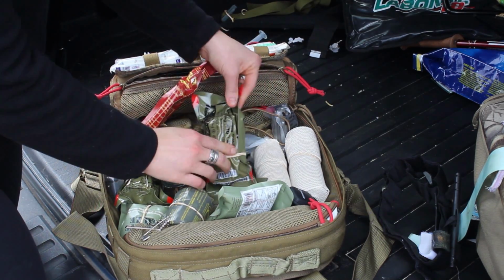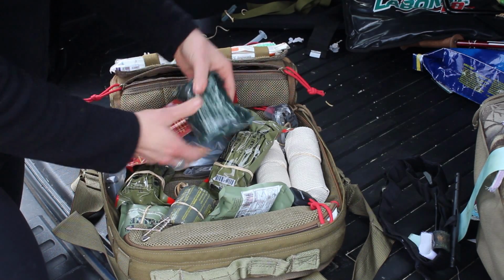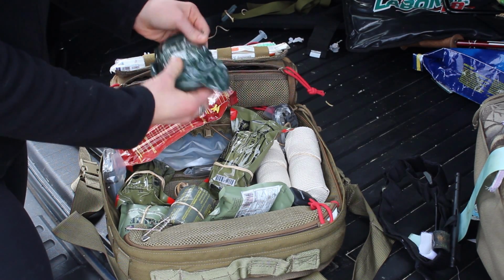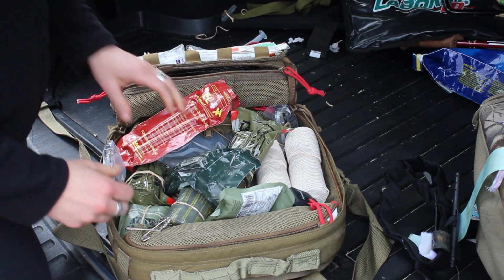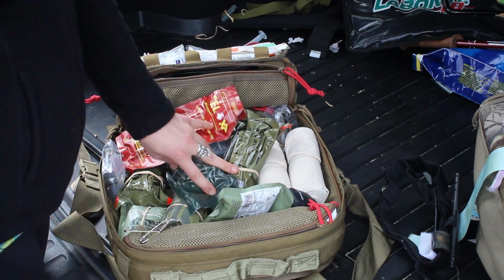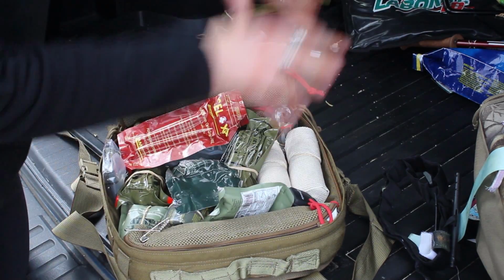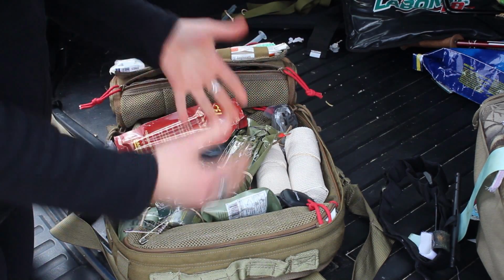Also, you will note that I have different bandages here. I've got a trauma bandage here, and then I have another one set here from North American Rescue, and this is just a NARP emergency trauma dressing. Okay, so the whole point here is that we have things set up so that the black swan scenario of somebody bleeding out, all of my equipment is here, it's easily accessible, and it is categorized based on what system I'm working on.